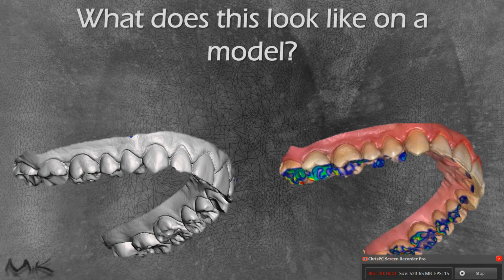So what does this look like on a model? Okay, so when we look at a model, we can see the difference right here. So this is a scan of some teeth that I took in my dental practice, and you can see one of them is converted to an STL, and one of them is in the manufacturer proprietary file format known as what's called a DXD file. So it's very similar to that of a PLY, but this is just manufacturer specific.